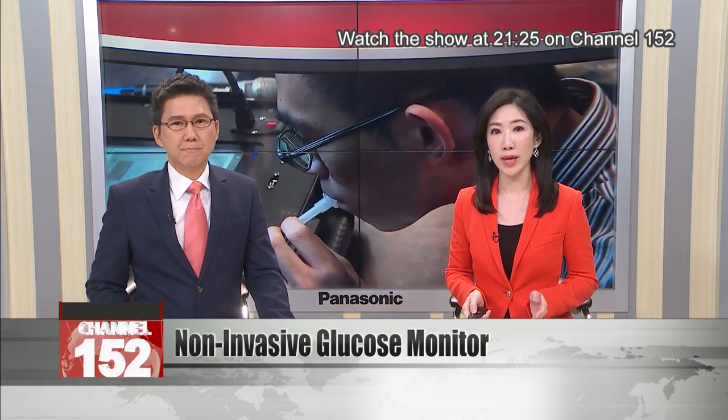People with diabetes have to keep track of their blood sugar levels, usually by pricking their finger with a needle. But what if there were a way to monitor glucose blood-free?